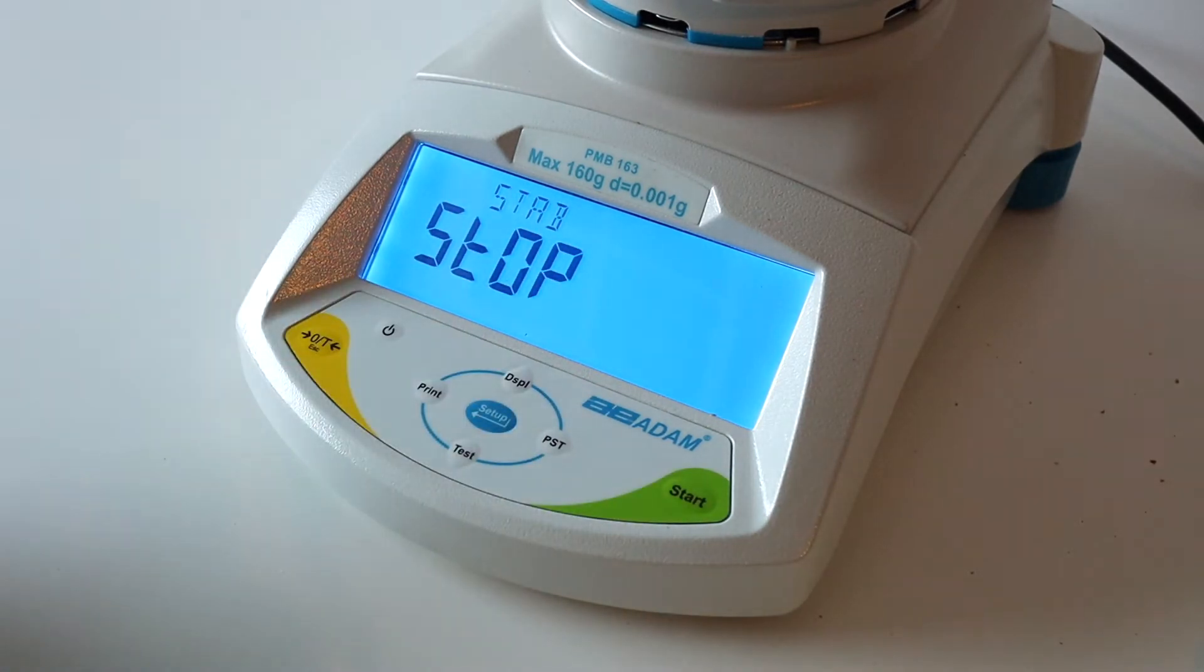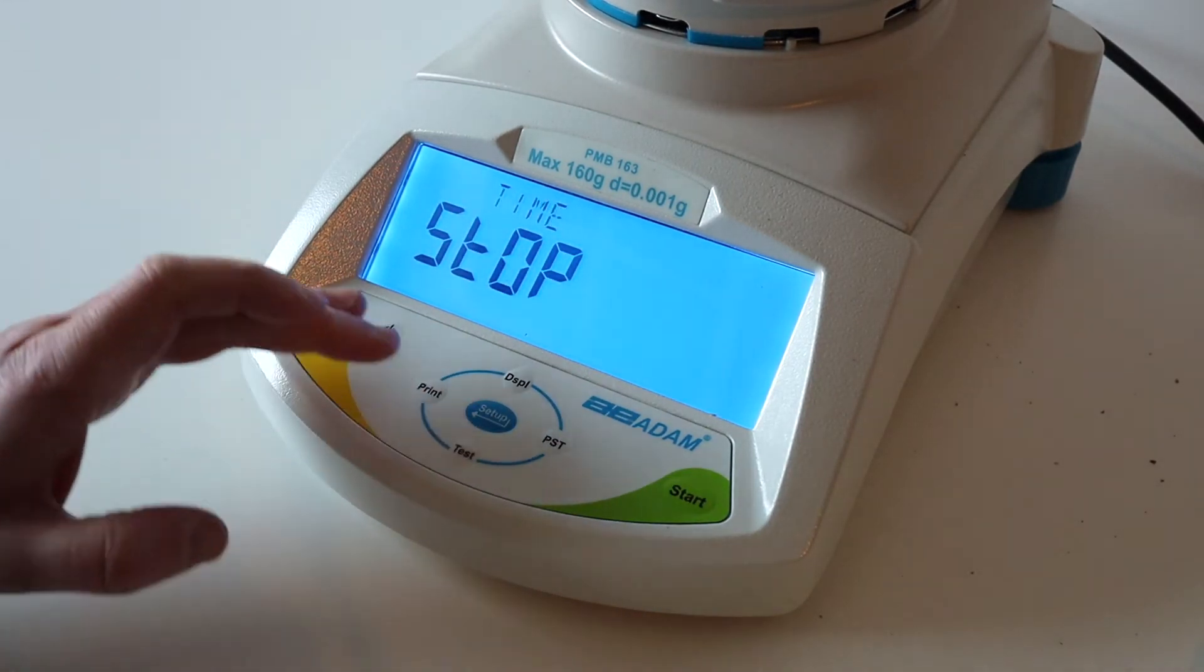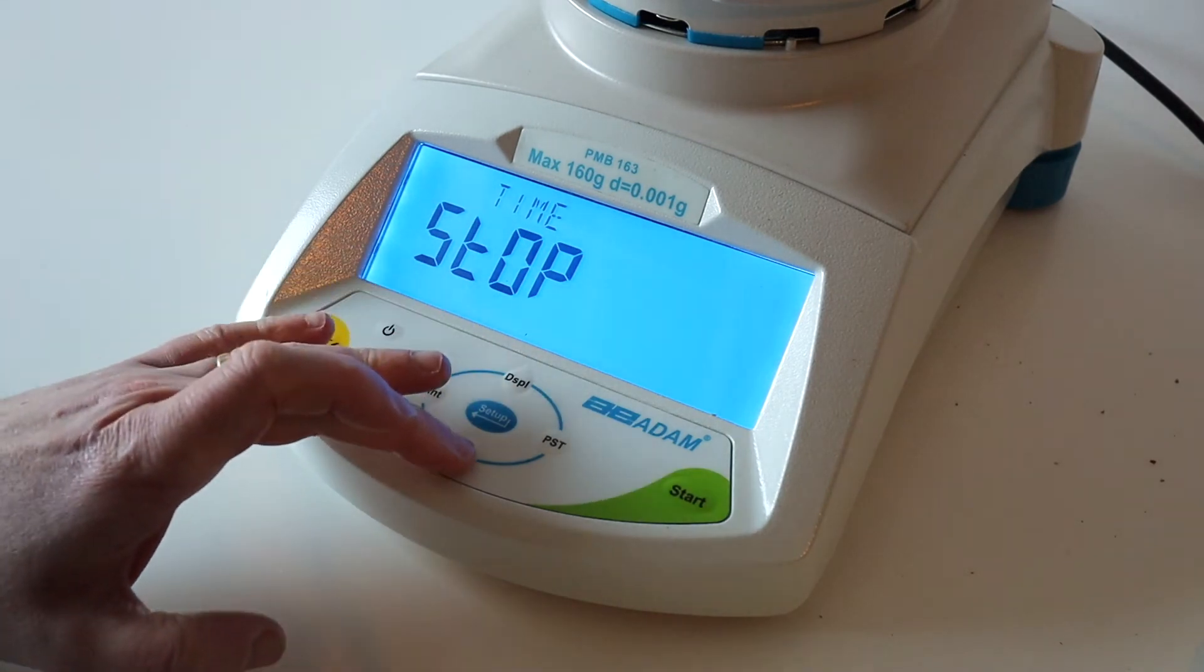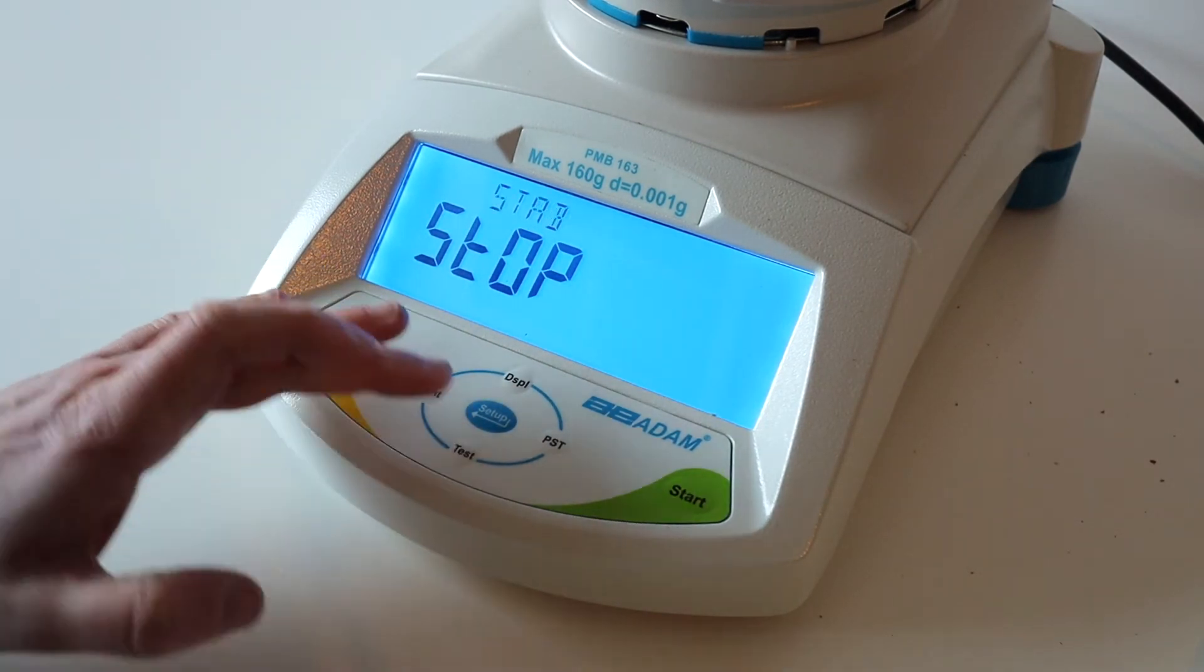Your time limit options are next. We recommend using STAB for first use. Press Setup twice.